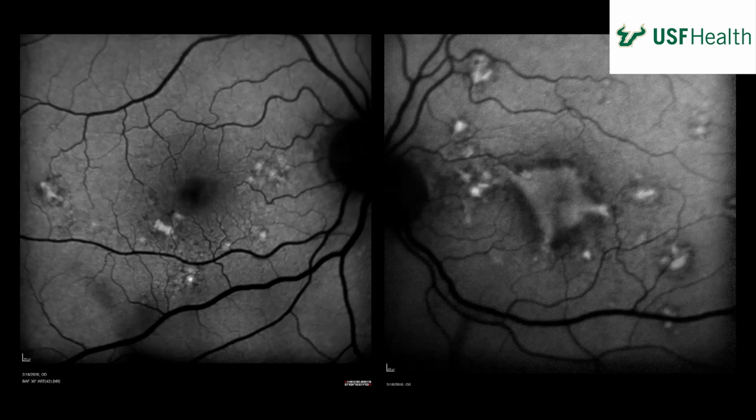It's interesting. It's in the center of the macula. Can you think of a reason why there might be a little less hyperautofluorescence there? Just based on its location? Like if you look at the other picture in the center of the macula. Yeah, it's a little bit thinner there, and it's supposed to be dark. It's probably the macular pigment blocking some of the autofluorescence.